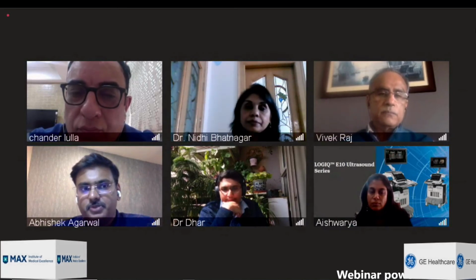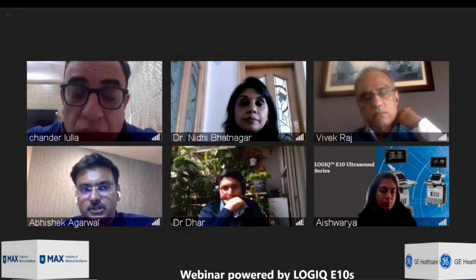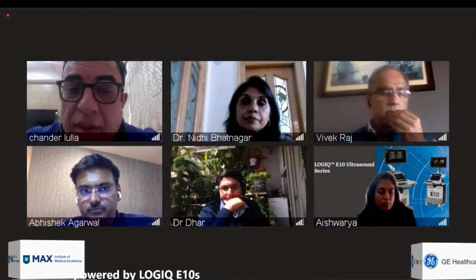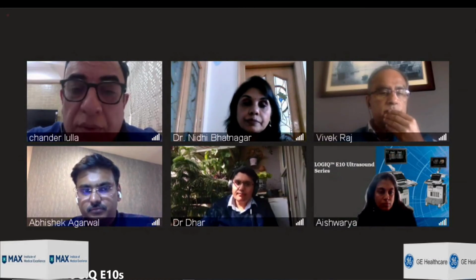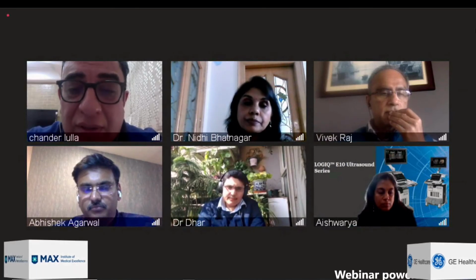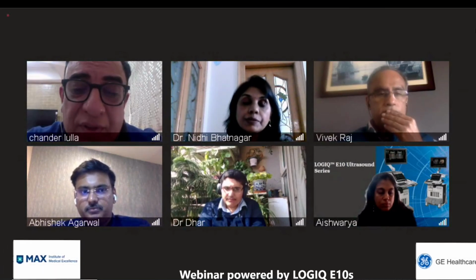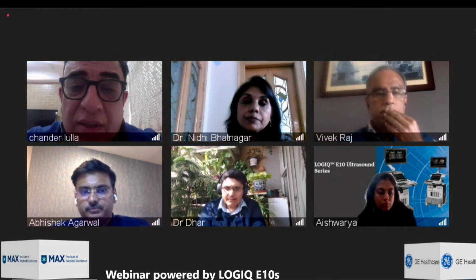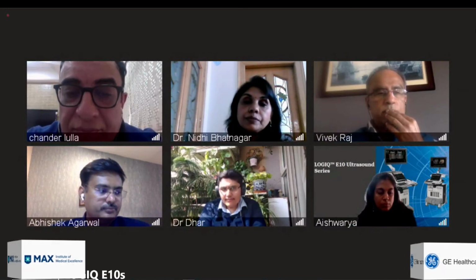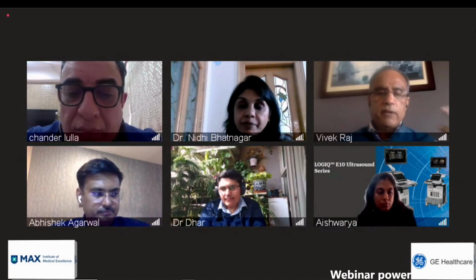So Dr. Lulla, do you give the rule of 4, or do you still give the Metavir grading on your reports? We do give the rule of 4. We give the SRU method, and we just give the value. Sometimes, if required, some clinicians who are not gastroenterologists do want to know what stage it correlates with, for example a physician or lifestyle clinic where they want to change the lifestyle of a patient. I think it's useful to have the F score: F0, F1, F2, F3, F4.